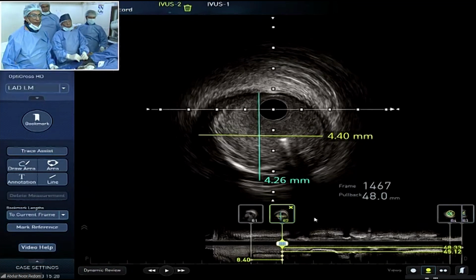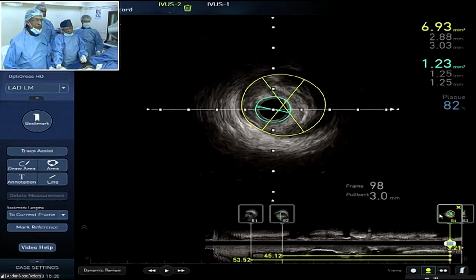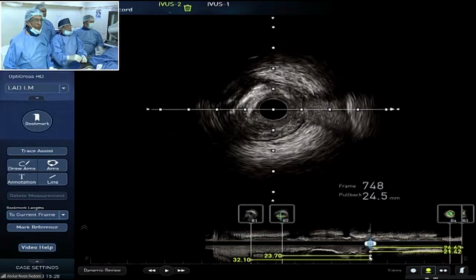I think it's difficult to do that. Either Synergy or Onyx are the ones that come close to it. Yes, but obviously you might lose some radial strength when we go up that high.